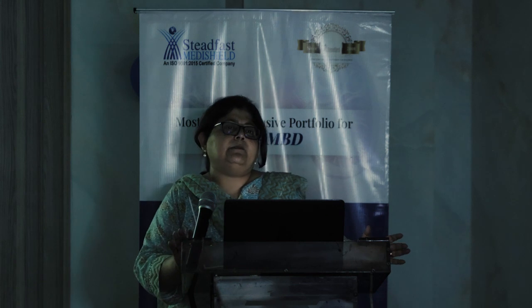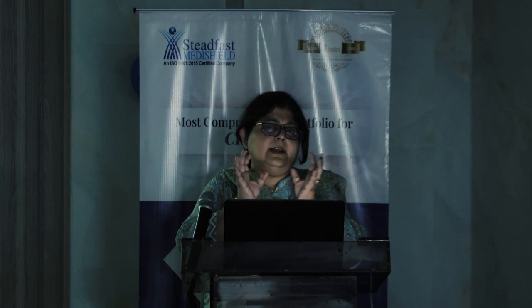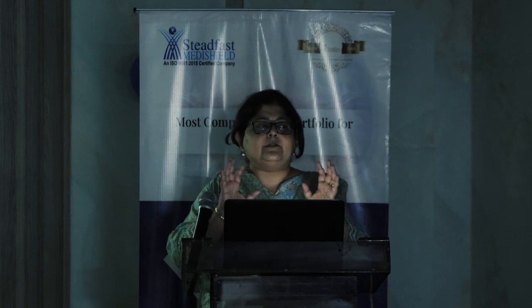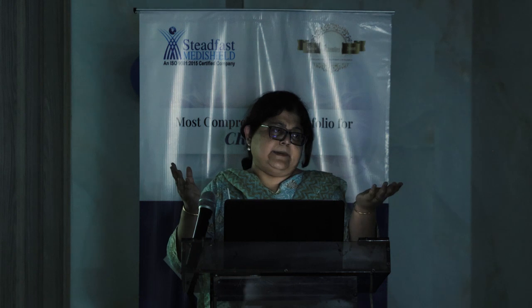The problem with the gamma camera method of calculating GFR is that there is a lot of calculation and a lot of assumption in these calculations, right? So in a normal sized patient, a 40-year-old 70-kilo patient, your GFR calculation is fine. But if your patient is very small, you may underestimate the GFR. If your patient is very fat, you may overestimate the GFR.